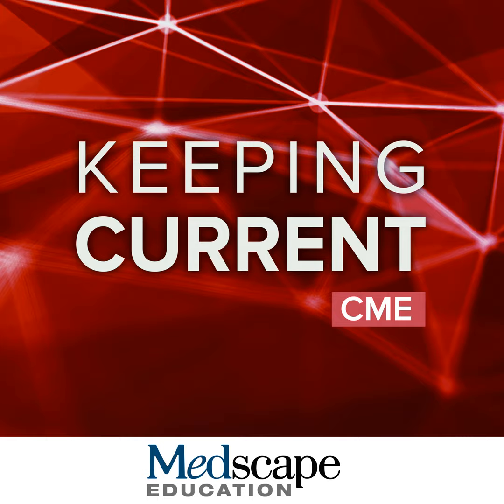So the key here is that not all ultrasounds of the liver are the same. We can see on the image on your left, in A, that's a good-looking liver. We don't see any distortion. We don't see any shadowing that's causing us not to see the liver. We can see pretty much everything on that, and if you scroll through this case, you'd probably see most of the liver, so there'd be no limitations.